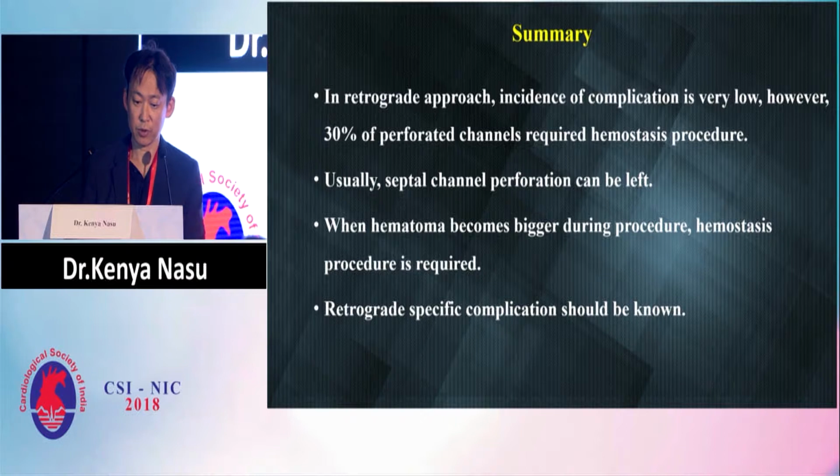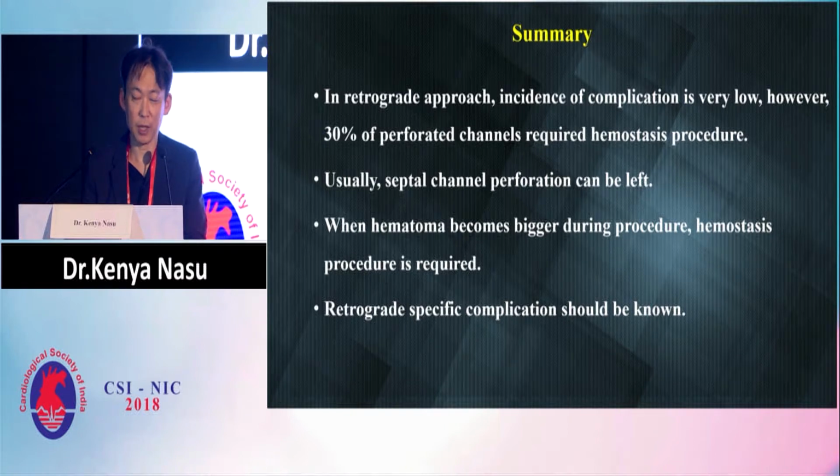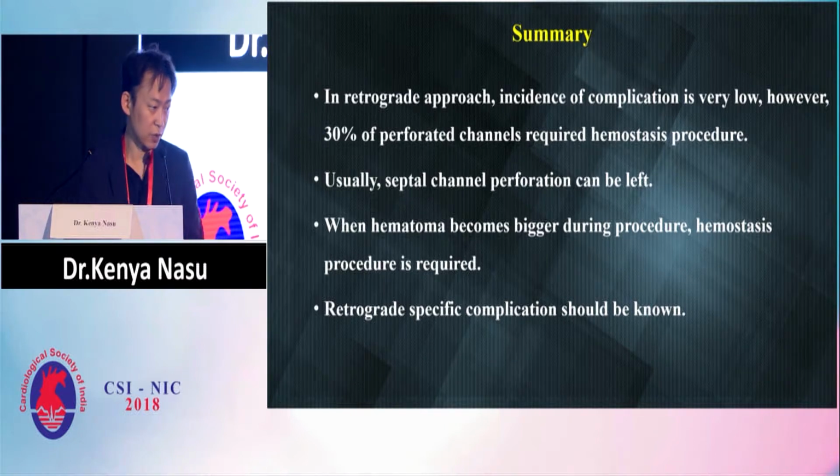This is the summary of my presentation. In the retrograde approach, the incidence of complications is very low. However, 30% of the perforated channels require a hemostasis procedure. Usually septal channel perforation can be left, but when the hematoma becomes bigger during the procedure, a hemostasis procedure is required. And the retrograde-specific complications, as I mentioned, should be known to complete the retrograde approach. Thank you for your attention.